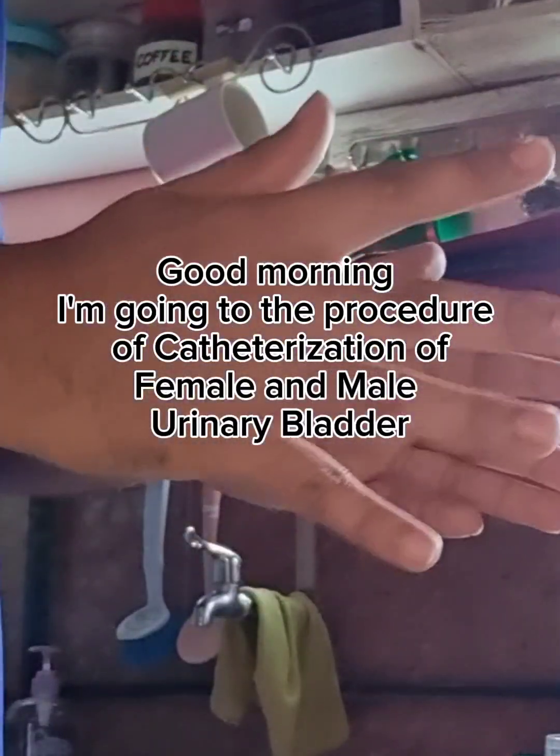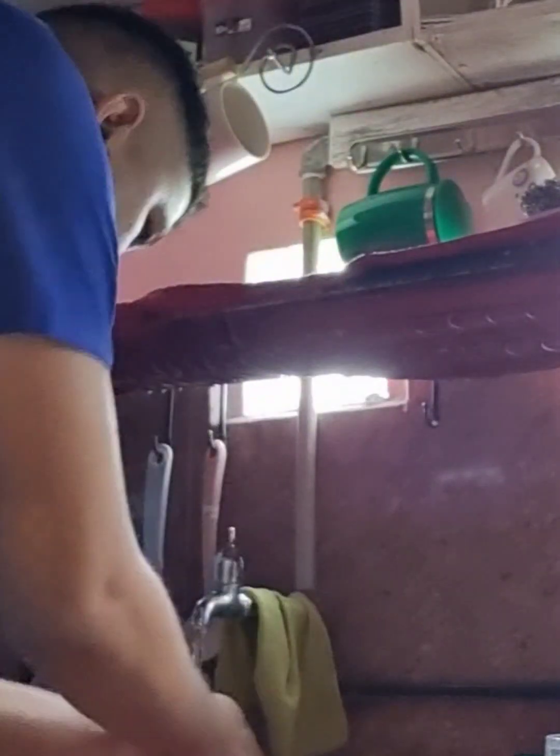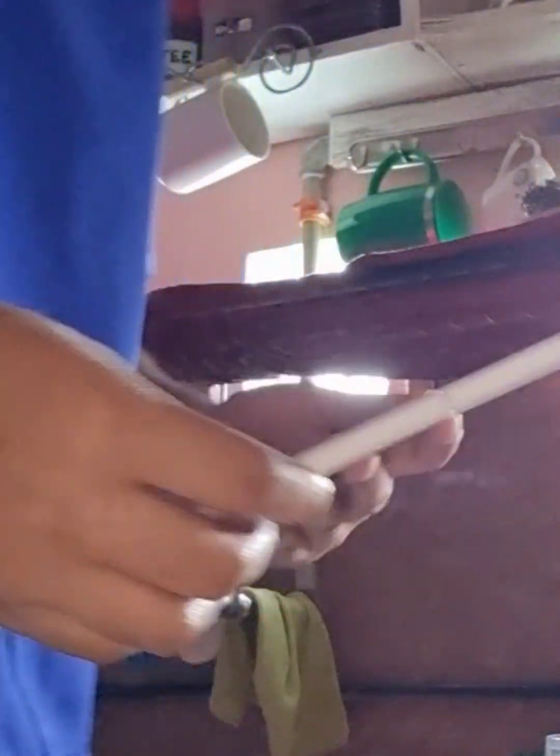Before entering the patient's room, we have to wash our hands to prevent any spread of infection coming from our part. And then we're going to rub our hands. First, we need to verify the doctor's orders. And then now let's proceed to the procedure.